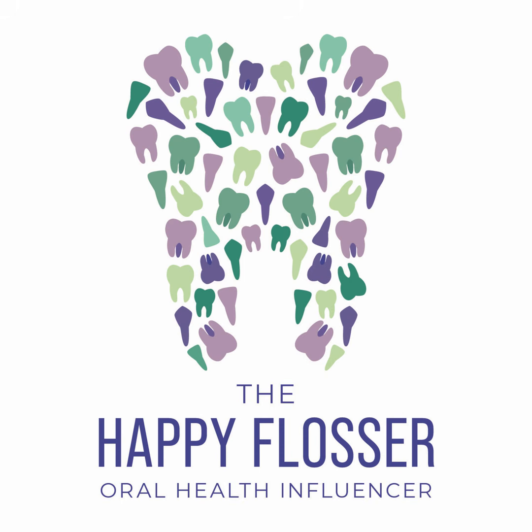The next thing that sometimes gets overlooked, that I think is vitally important not only for your ergonomics, but for how well you're able to get the impression tray into the patient's mouth and actually seat that impression correctly, is the patient's positioning.